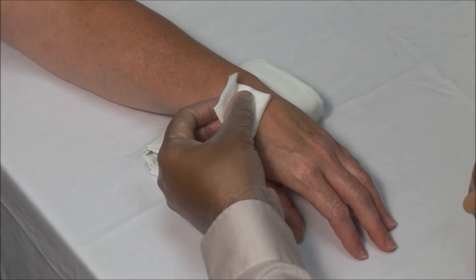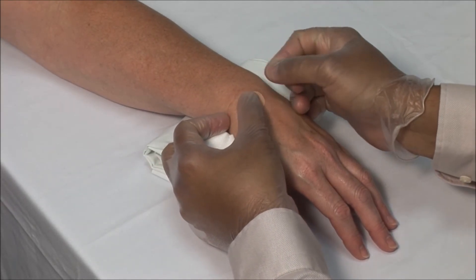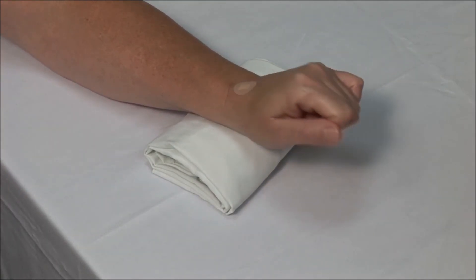Dry the area and apply a bandage. Have the patient move the wrist to disperse the medication.